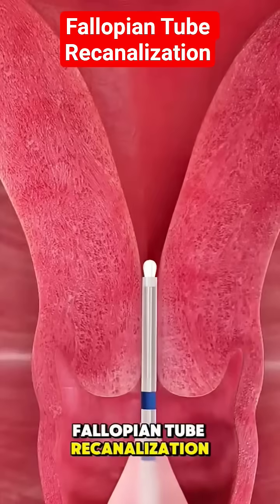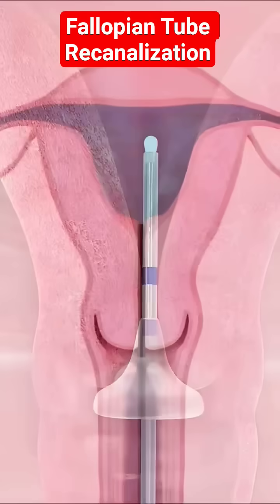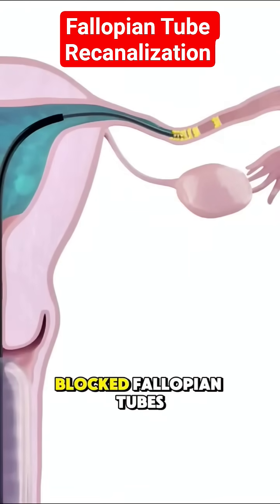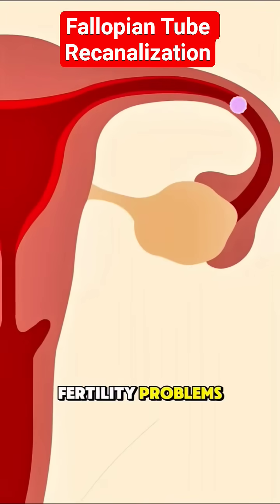Ever wondered how fallopian tube recanalization is done? Fallopian tube recanalization is a procedure used to open blocked fallopian tubes, helping women with fertility problems.